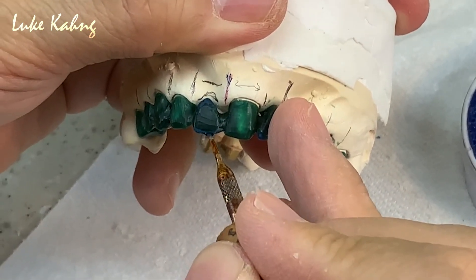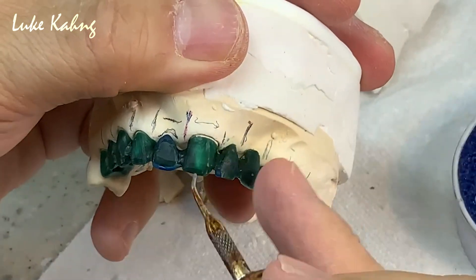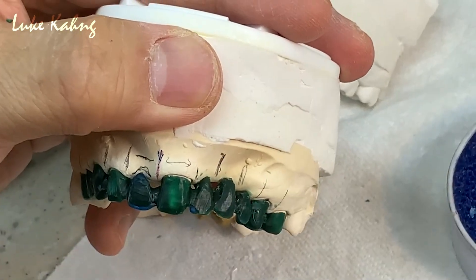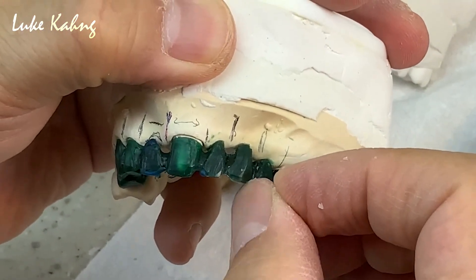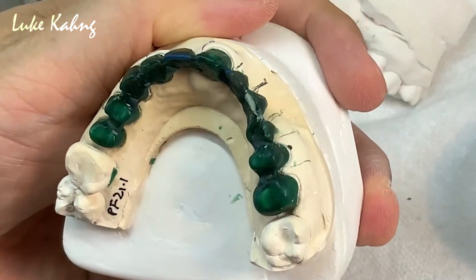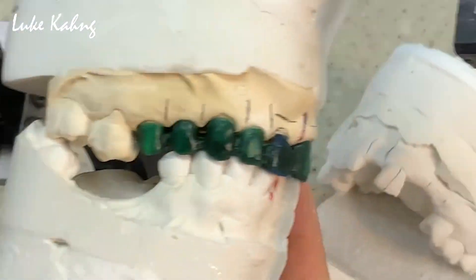Still I have to add just a little bit. Once you set up the central, then go to the lateral — lateral, okay. Once you go to the lateral, then go to the canine, which is still high so I can cut it. Then you can mount it with whatever cases you have.